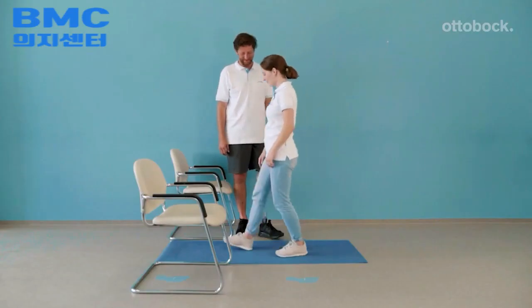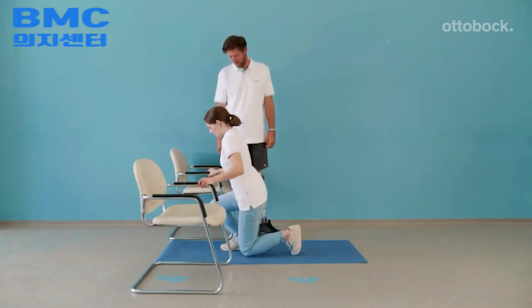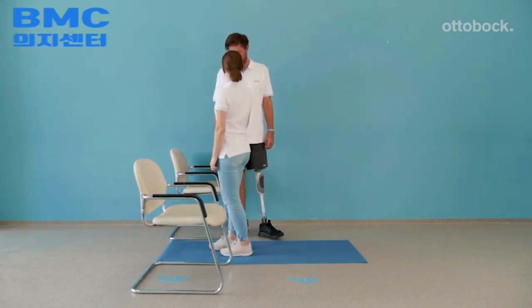With the 3R85 knee, kneeling is possible using the hydraulic resistance. The method shown is only one example, and variations can also be trained.